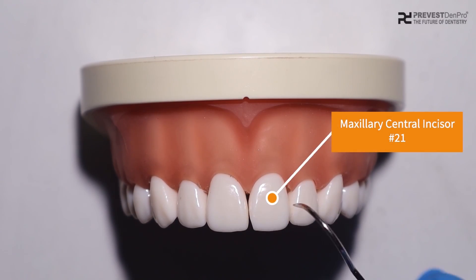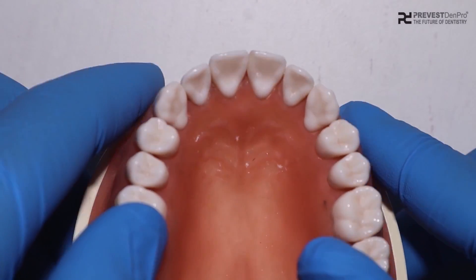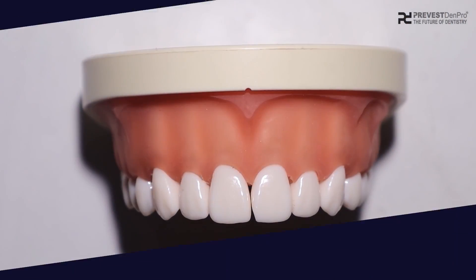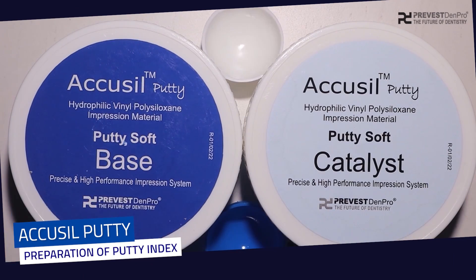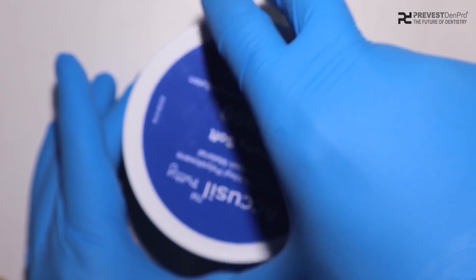In this video we are going to fabricate a temporary crown on maxillary central incisor 2-1 using Oratemp C and B. To begin with the fabrication of the temporary crown, we need to first make the putty index.